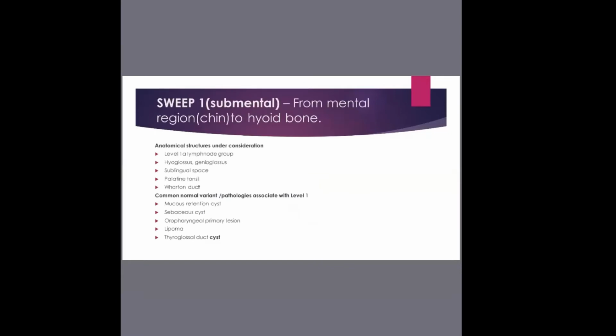When you say sweep 1, now when a patient comes for a thyroid scan, I want to advocate this. Try to look at the rest of the neck. Don't just do the thyroid. And please, I just need to say this because I think most of our people do this a lot. We're not interested in the measurement of the thyroid.